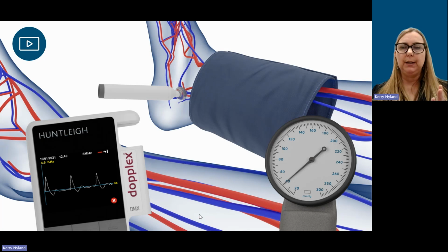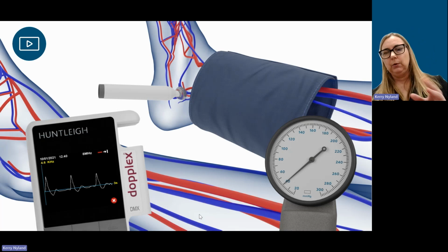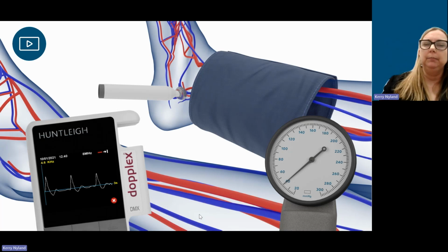Another important thing to check is that there's enough room for the cuff to inflate. If your patient's got a really heavy edematous limb, the weight will make it harder to inflate the cuff. So see if you can get a finger underneath the cuff before you start, just to check it's got room to expand. If not, perhaps see if you can get something under the heel just to create some room there.